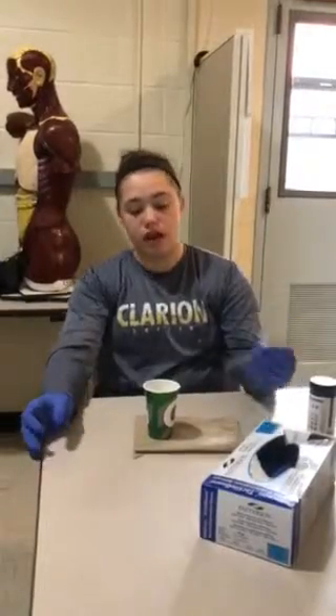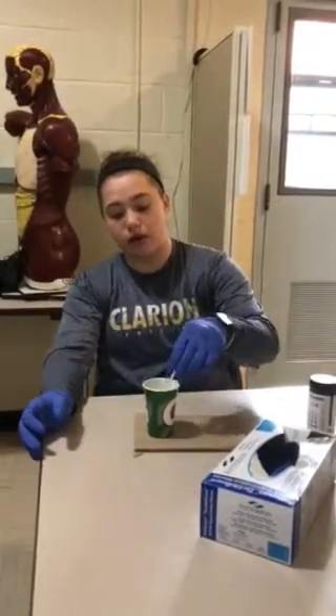The athletic trainer should have gloves on by the time they receive the cup. Then you want to place it on a flat surface to avoid any spilling. Then you will take your chemically treated sample strip and dip it into the urine for about one second, then tap on the edge of the cup to remove any excess urine and blot it on a paper towel to do the same thing.